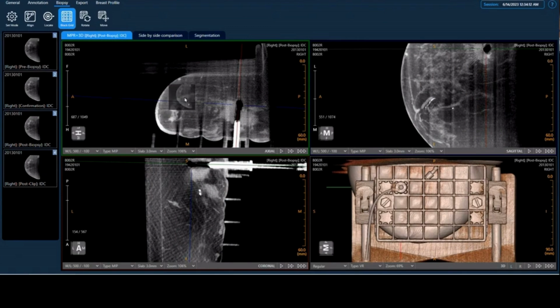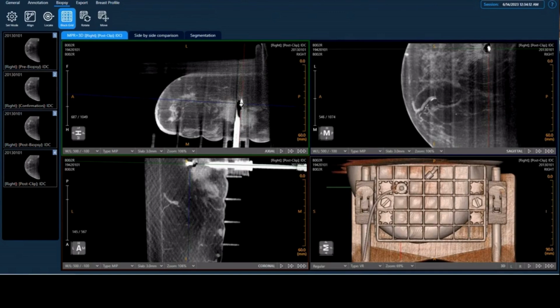And then they can place a biopsy marker, and we have a fourth scan to confirm the marker has been placed in the correct location. Basically, with these 4 scans, typically the whole procedure can be completed in approximately 15 to 20 minutes. Usually radiologists, if they have experience in MR guided biopsy, may find this procedure very familiar. It's just much faster.